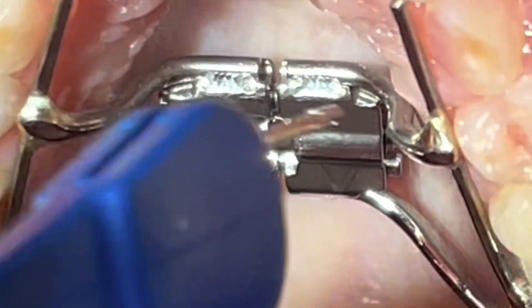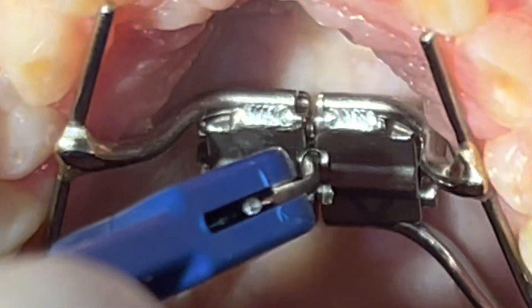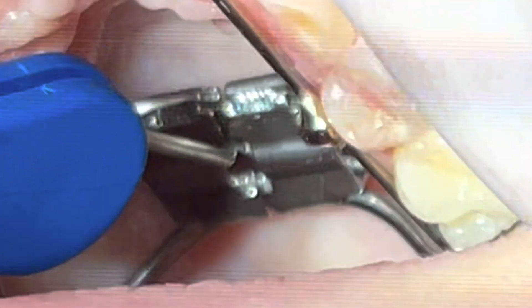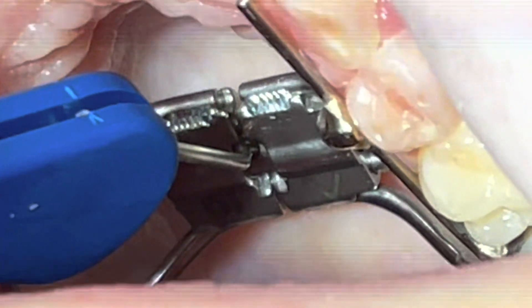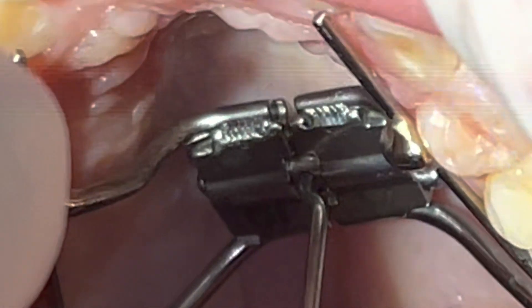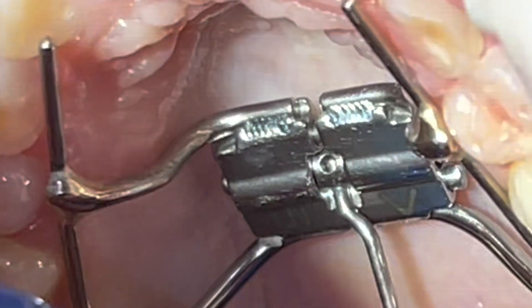In this video I'm going to show you how to expand the fixed Hyrax expander using the expansion key. Most patients at the beginning find some difficulty locating the small hole in the middle of the expander, so I'm zooming in to show you the right insertion way, right insertion angulation, and how to turn one complete quarter turn.